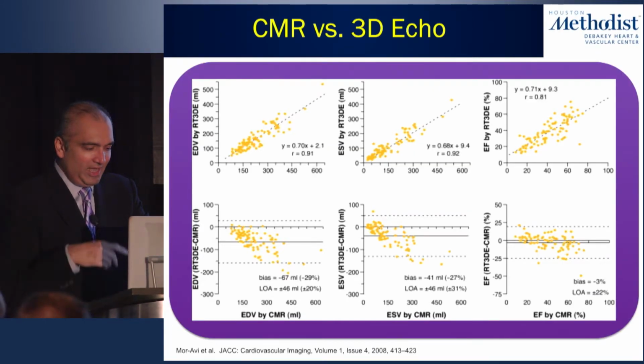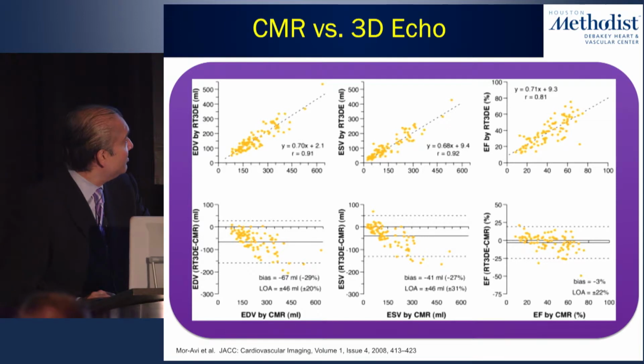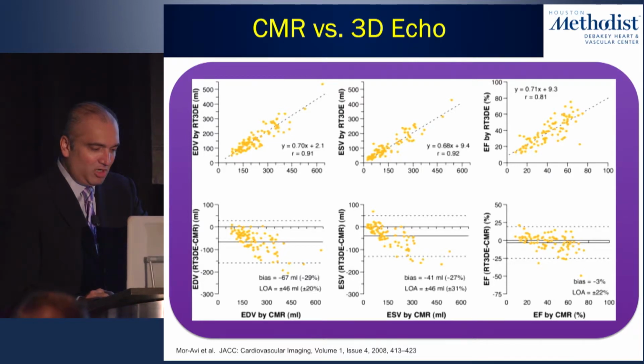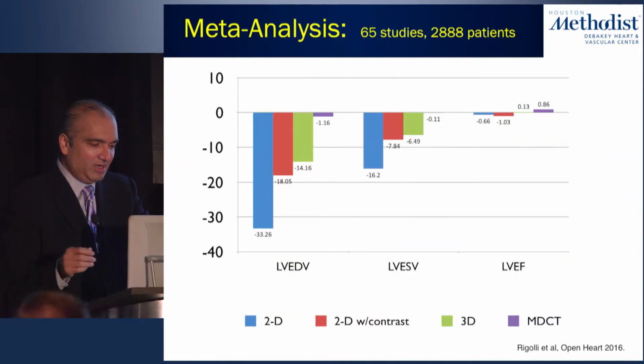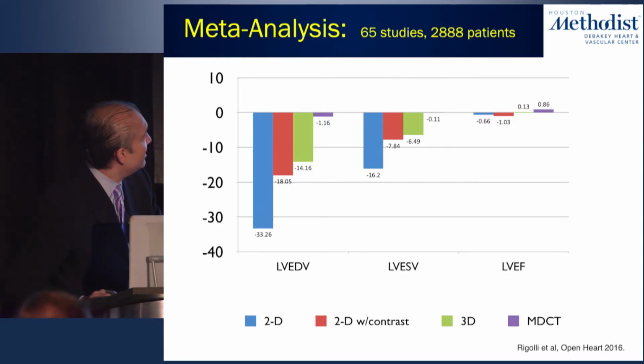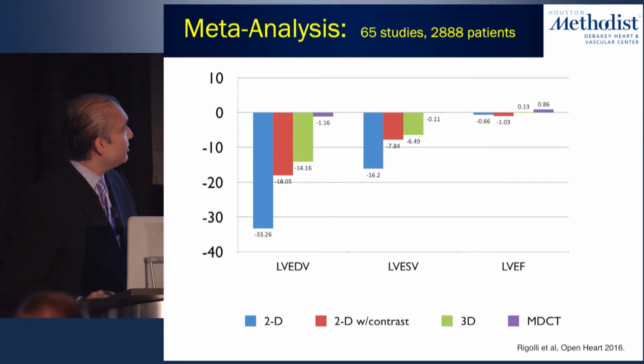Now, what's the reason for that? I think Roberto very nicely published a study a few years ago trying to investigate the reasons for these discrepancies between CMR and echocardiography. I'm not going to bore you with it, or go into too much detail since he already touched on this. But I think the findings that he demonstrated in his study were also demonstrated in numerous other studies.